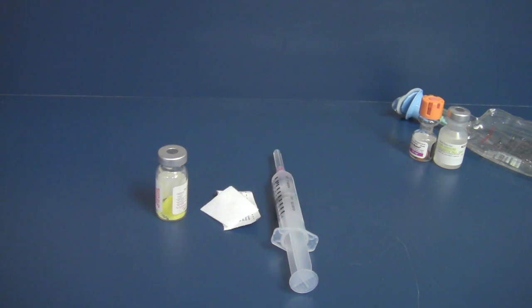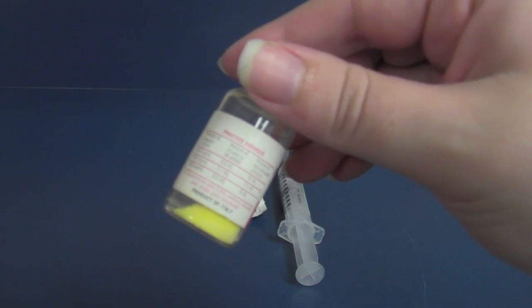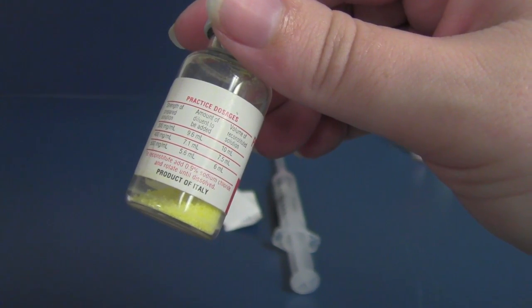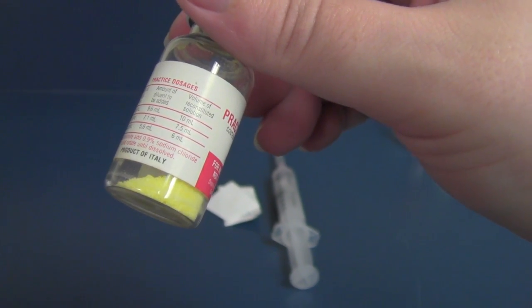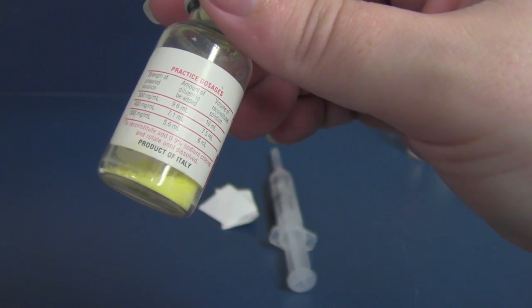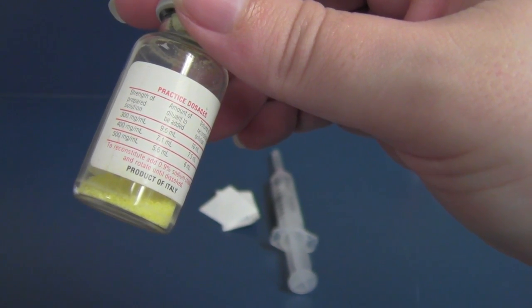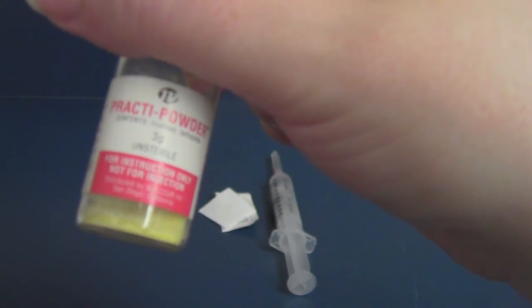You need to refer to the MAR or the vial of medication itself to figure out how much solution you need to add to reconstitute the medication. For this medication, we're going to add 5.6 milliliters so that we get a total volume of 6 milliliters of medication, to get a concentration of 500 milligrams per milliliter of our Practi medication.